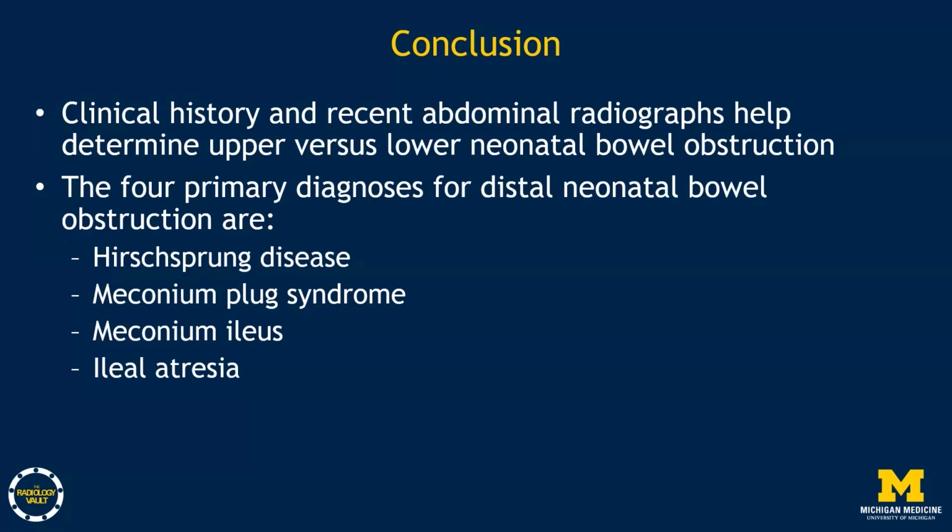As an aside, when doing neonatal fluoroscopy, keep in mind that it's important to have appropriate support staff with you and to make sure that the environment is conducive for the patient, specifically multiple blankets and warming apparatus, since the neonate is not homeothermic to a complete extent in the neonatal period.